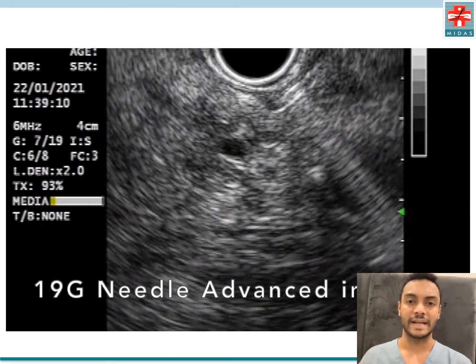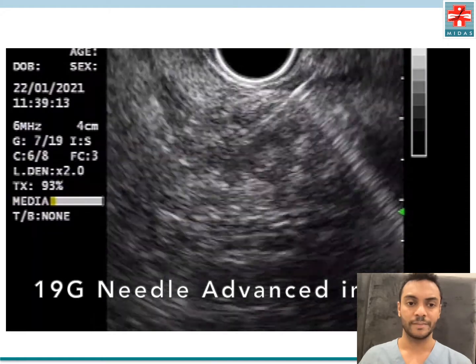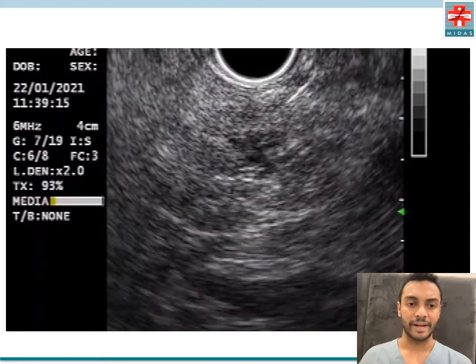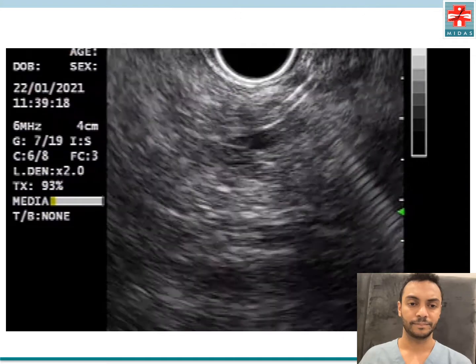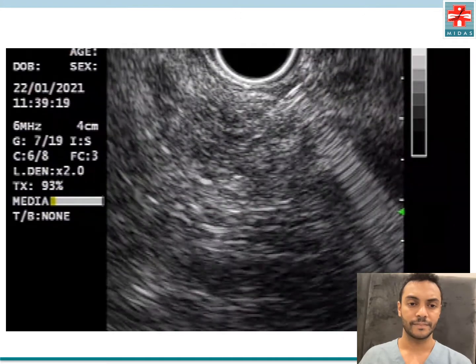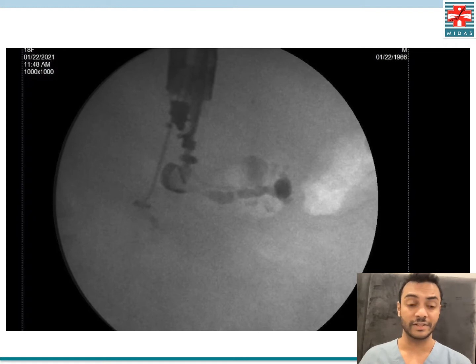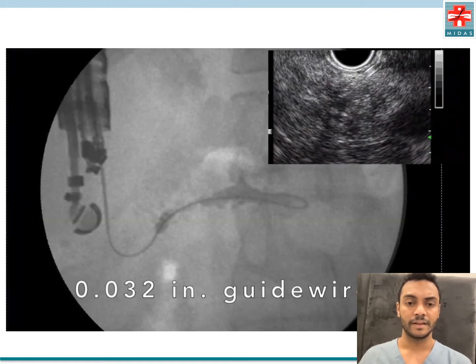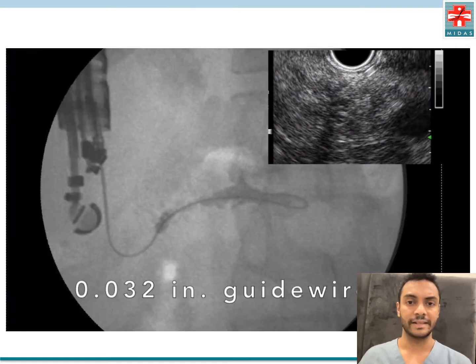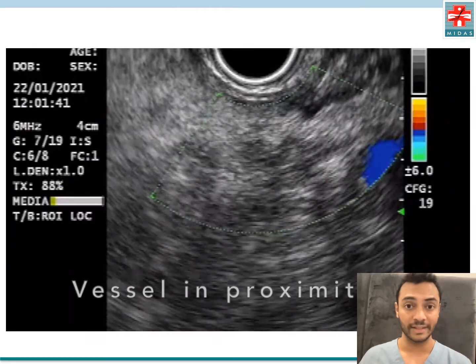Next, we advanced a 19-gauge needle across the gastric wall into the pancreatic duct in the body. Contrast was injected to confirm presence of the needle in the pancreatic duct. Next, a Terumo 0.032-inch guide wire was advanced into the pancreatic duct.